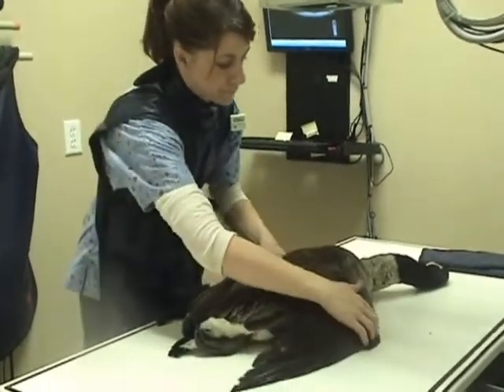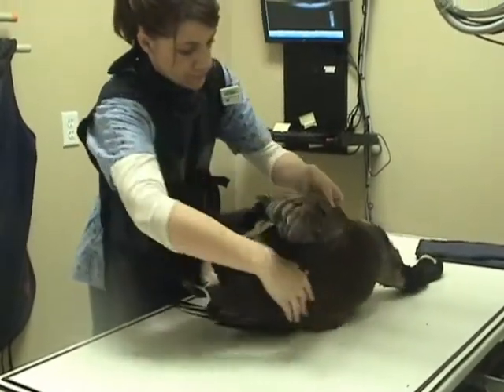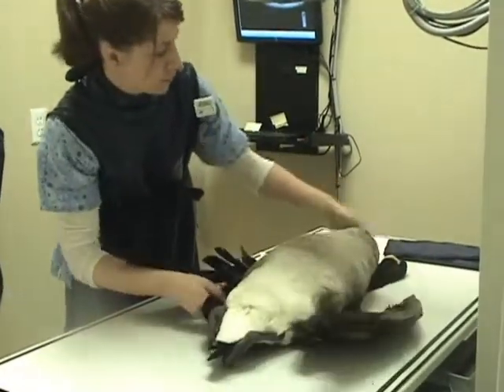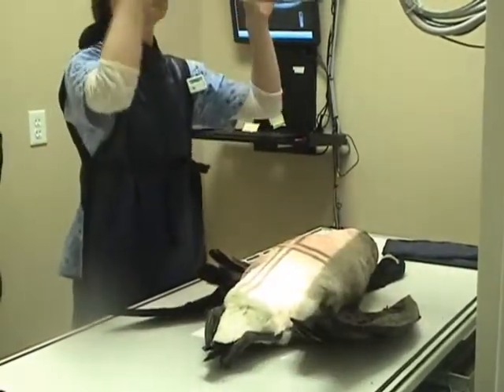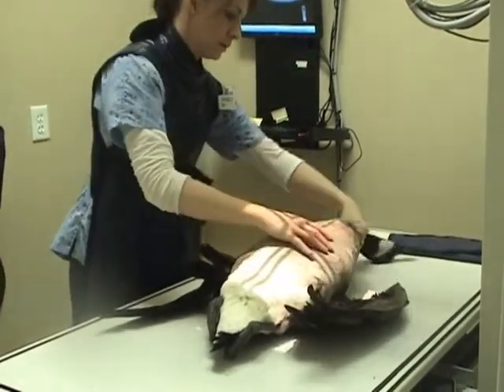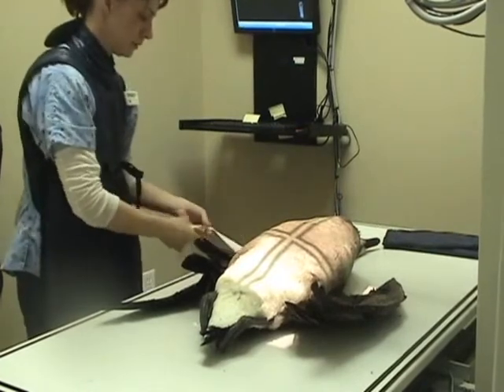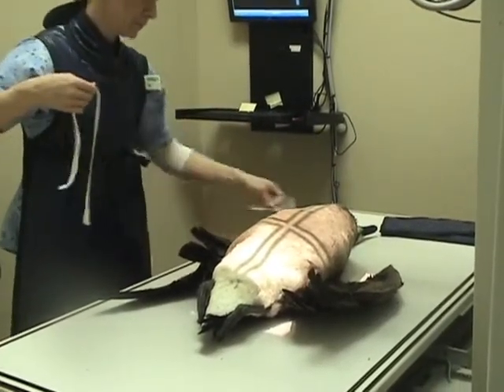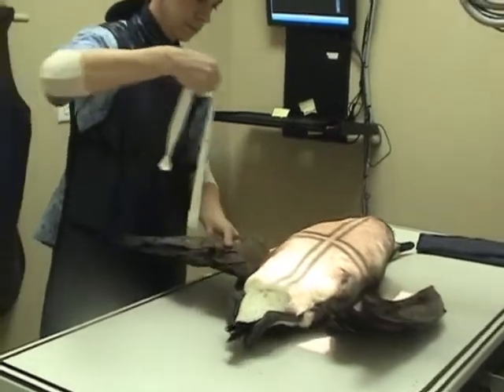Avian patients are usually not measured with a caliper to calculate the exposure. Normally, exposure factors are chosen according to the species and size of the patient. Following Table 20-1 in our radiology textbook, a setting of 64 kV and 20 mAs was selected. This was somewhere between the settings for an eagle and a trumpeter swan. Our subject weighed 10.4 pounds.